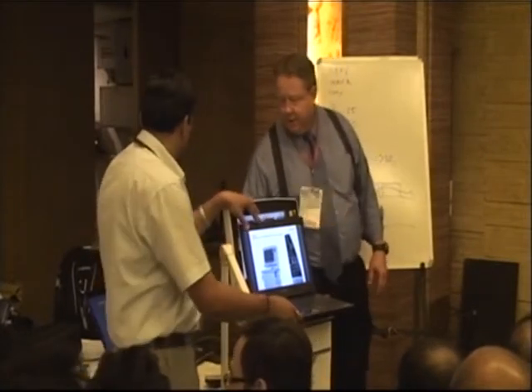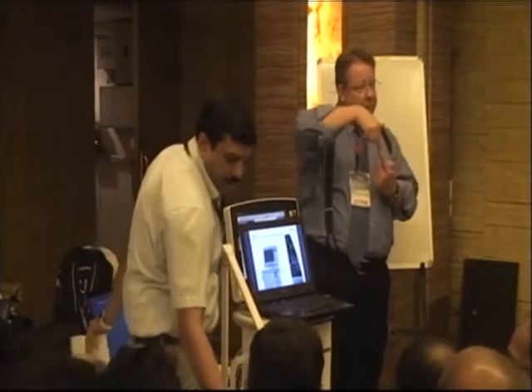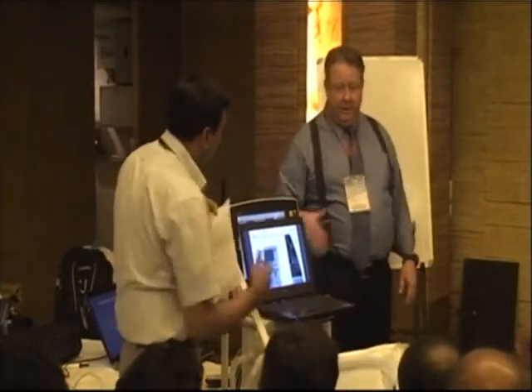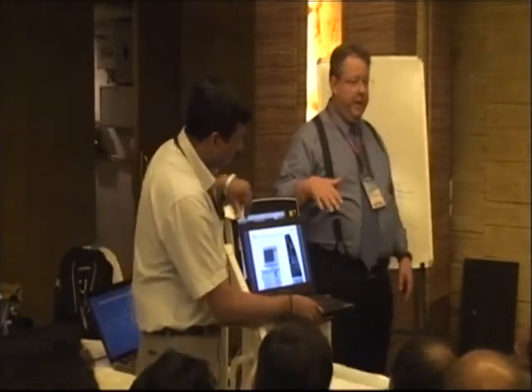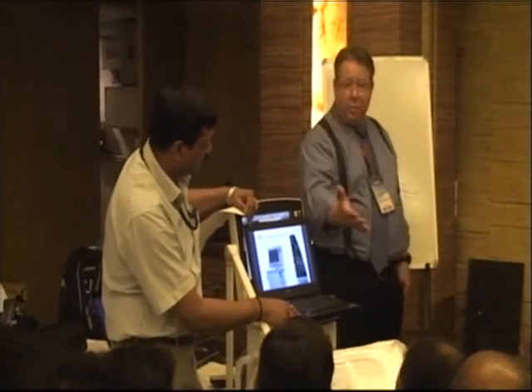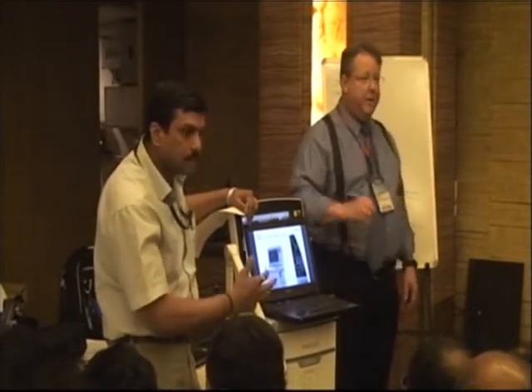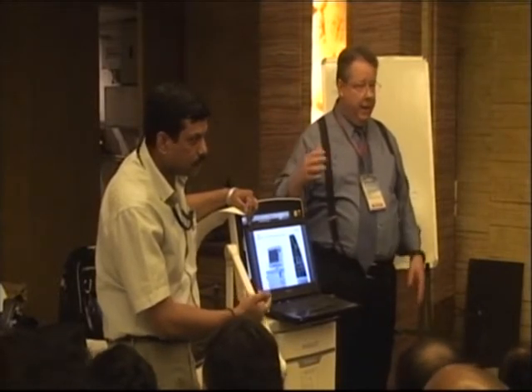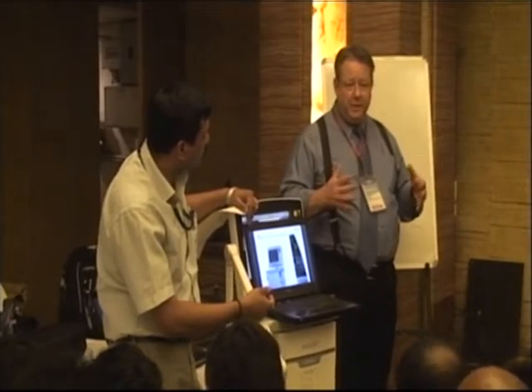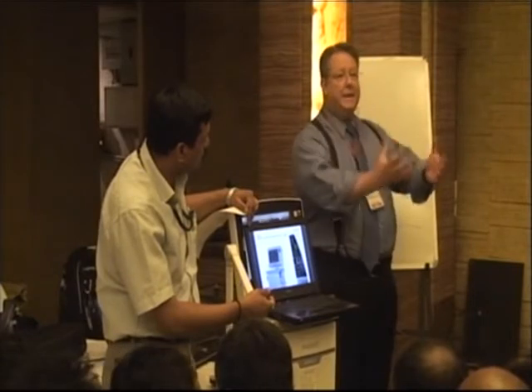It uses a catheter that has multiple sensors that are at the bottom of the esophagus where the diaphragm is going up and down. When we place that, we'll get deflection to know we're in the right place, and then it follows diaphragm activity and interprets that activity to sense a breath. So when the diaphragm triggers it, you get a breath that started from a diaphragm movement, not from flow changing in the airway, which, as you well know, is hard to sync with a fast-breathing patient or a patient who has a lot of airway resistance, because they're breathing back and forth, and by the time the ventilator catches up to what they trigger, they're actually exhaling already.